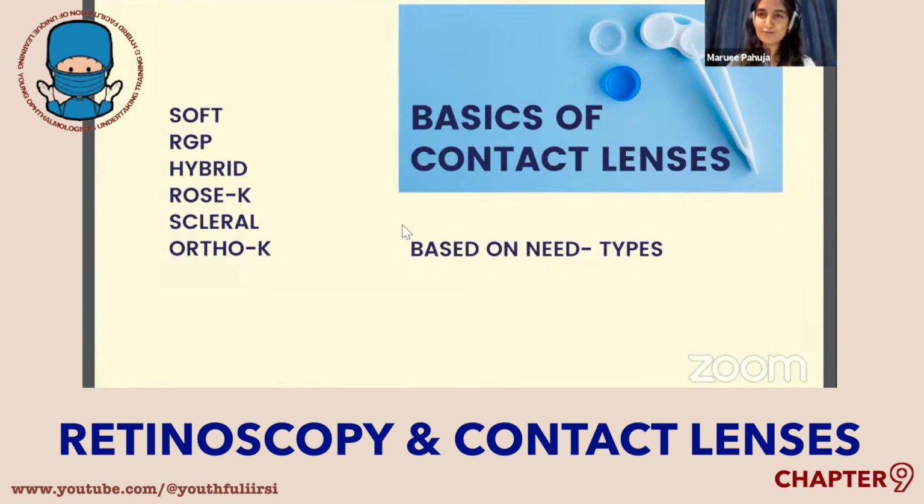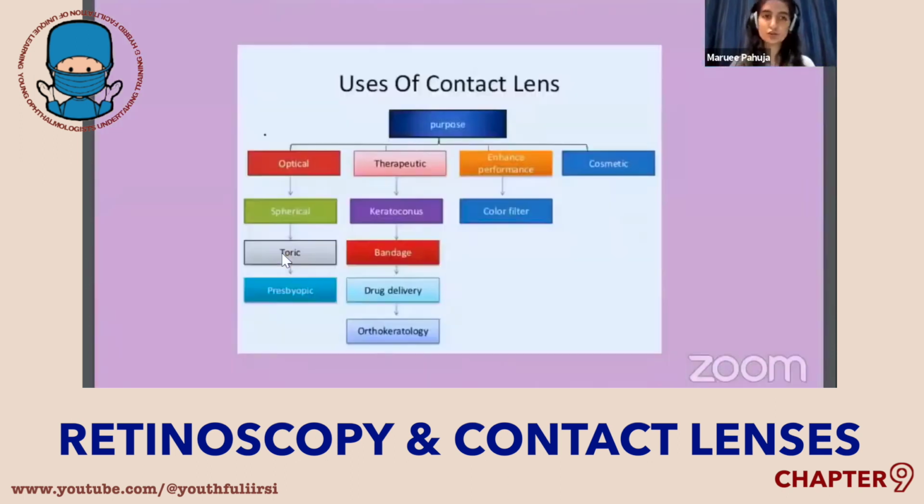Now, my special love, which is orthokeratology, and I will be touching a little bit upon orthokeratology in the coming slides. And OrthoK lenses, as mentioned earlier in one of the slides by Dr. Matalia, address how we stop the progression of myopia, since it's so prevalent and we are dreading the future of myopia. What are the interventions that we can take at this point to stop the progression of myopia? OrthoK lenses happen to be one of those.